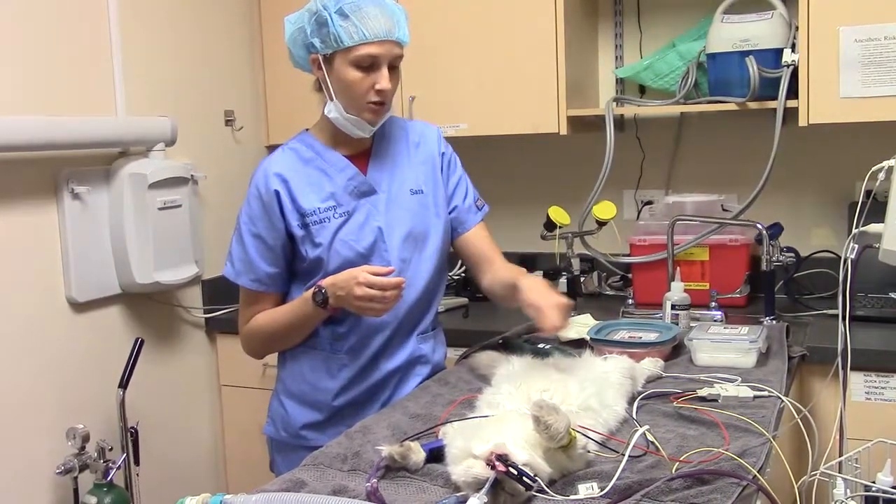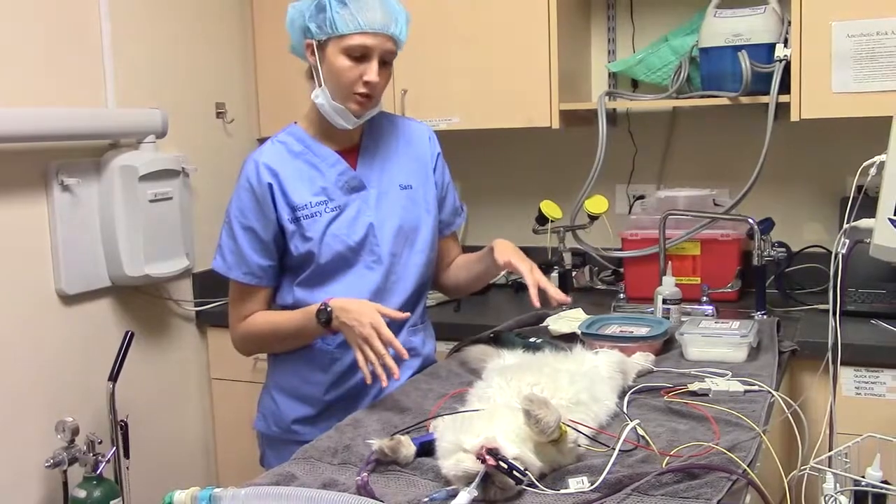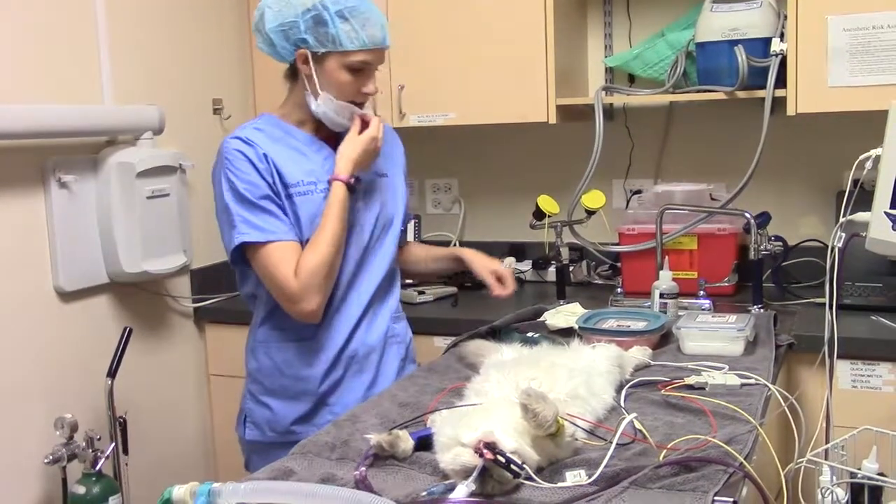When we're scrubbing, we'll go in a circular motion, making sure we start in the middle and work our way out, not going over anything we've already scrubbed. So we'll go ahead and shave.